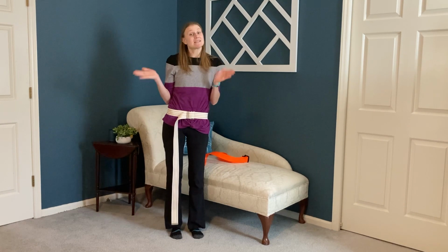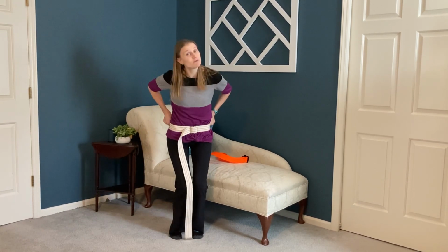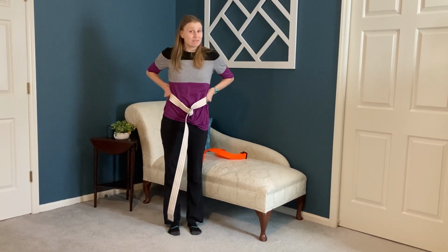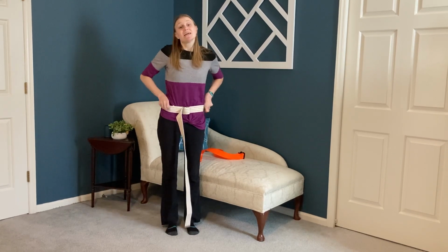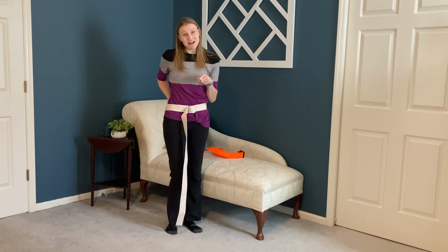So again, concept of gait belts: low and tight across the hip bones. Be careful if you're going to be lifting up, because even though this is very tight, it pulls up very, very easily. Consider using your hands for stability during the transfer, and then having this gait belt as your option to help somebody with stability and balance once they're up.